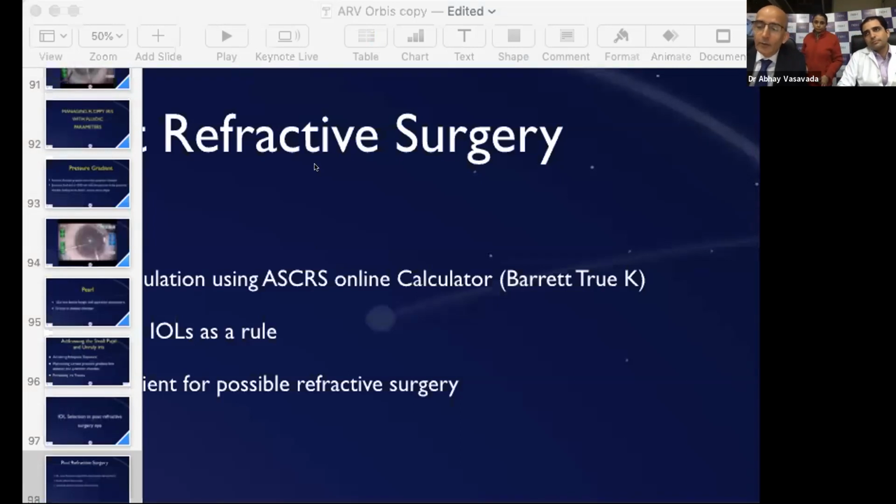In the beginning, in the evolution of our experience and developing an expertise on phacoemulsification, I would advise you to consider extracapsular or small incision manual cataract surgery. In the beginning, there's no shame in doing a large incision extracapsular or a small incision cataract surgery, but once you develop a consistency in phacoemulsification, you will be able to do a much better job, even in a dense cataract or all of these myriads of challenging situations, some of which we dealt with today.